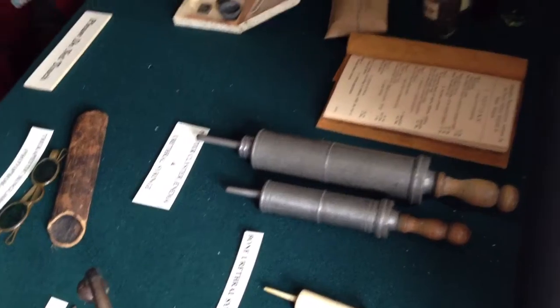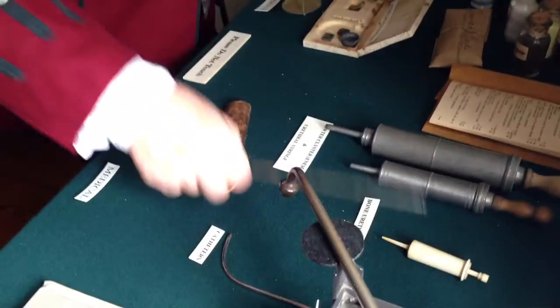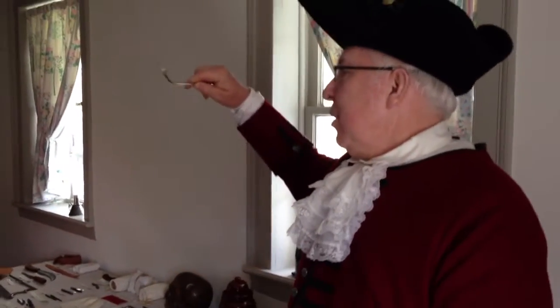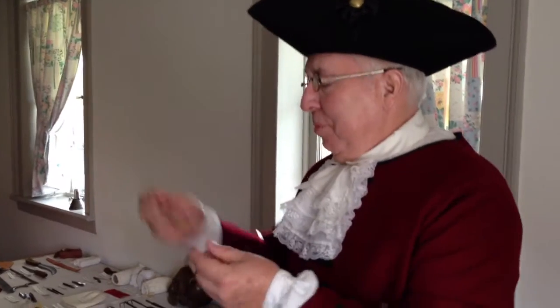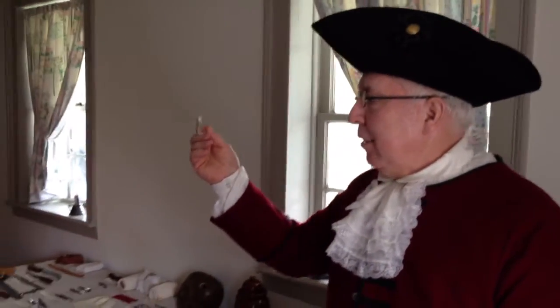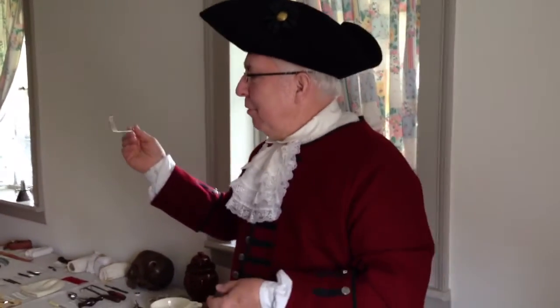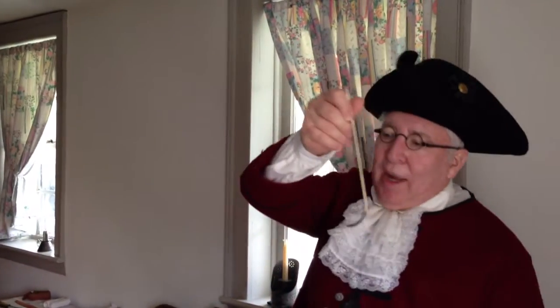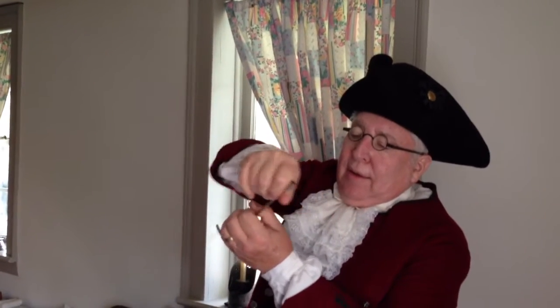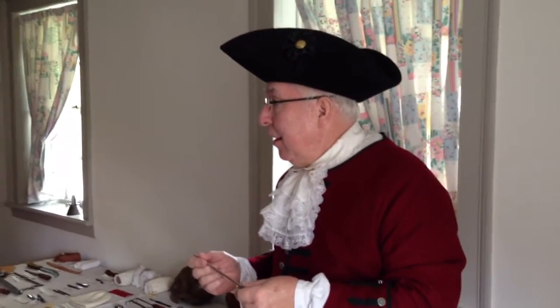And these are catheters of the period. Now, can you imagine that going all the way into the bladder? Women were luckier; their catheters were only about this long, but the men had these big long ones with a curve in them. And you say, "I wonder who did that." Well, you went this way and you held the penis this way, and threaded it.